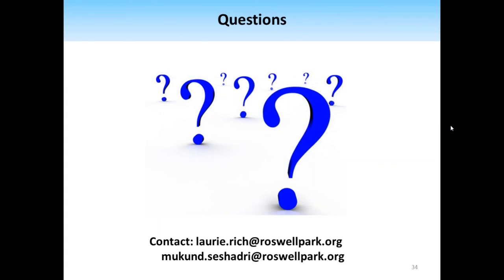Yeah, so that's a really great question. Even though BOLD-MRI is dependent on the levels of deoxy and oxyhemoglobin, it's completely different than photoacoustic imaging, because BOLD-MRI is also dependent on magnetic properties of tissue, which can be influenced by things like blood flow or the degree of hypoxia within the tumor, or even dissolved oxygen levels. And photoacoustic imaging is more of a direct readout of the oxygen saturation levels. So maybe in some senses that's why in these studies we saw a little bit higher sensitivity with photoacoustic imaging, because we're directly measuring the levels of oxy and deoxyhemoglobin, and we're not susceptible to some of these other things that MRI could be.